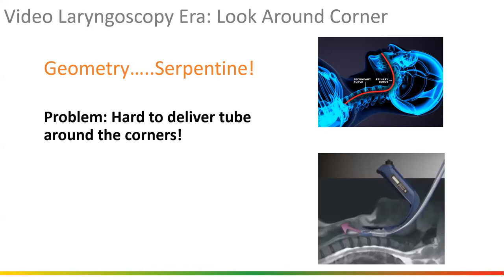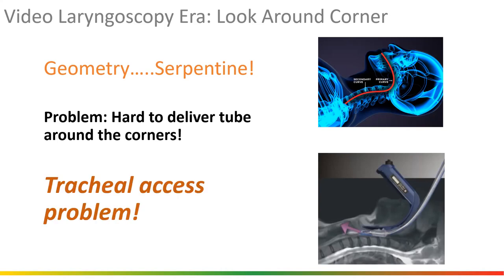Everybody's experienced this problem. I'm not going to go through it, but intuitively you've experienced it. It's when you get to the glottis and you start corkscrewing that stylet or the endotracheal tube, pull the stylet back to relax the endotracheal tube, and then you start corkscrewing. Now that can't possibly be good for the glottis or the trachea. And we know at this point that it's not.